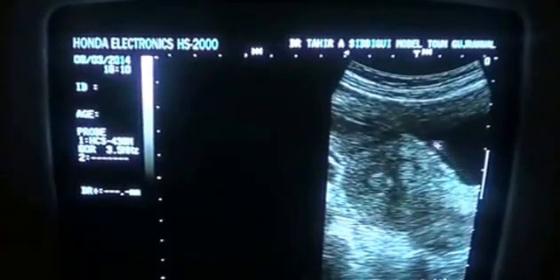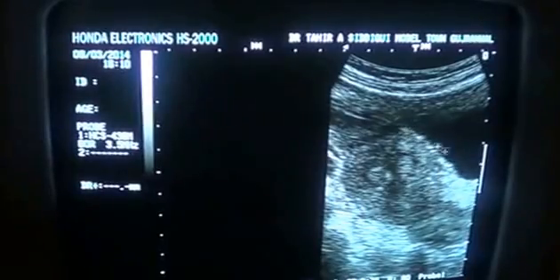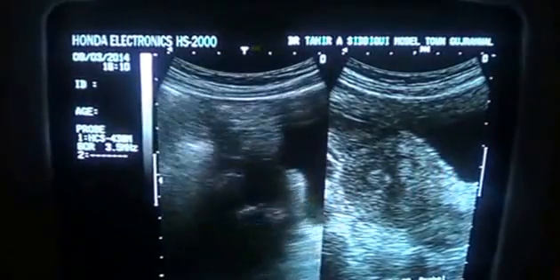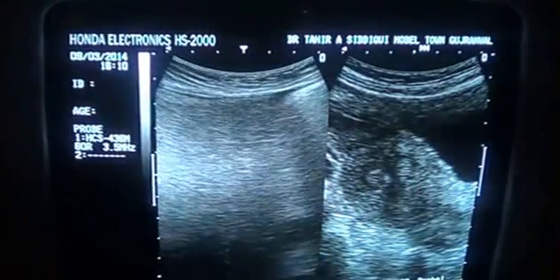It should be as sharp as this anterior margin of the outer wall of the uterus, but you see here it is muffled, and when I move the probe a bit anteriorly, it becomes apparent.